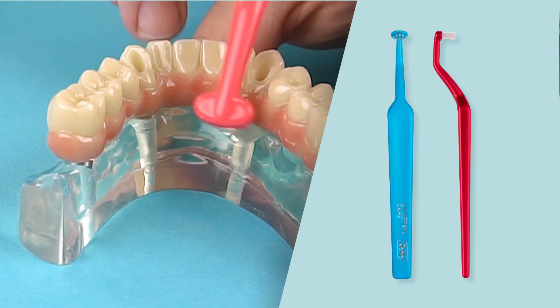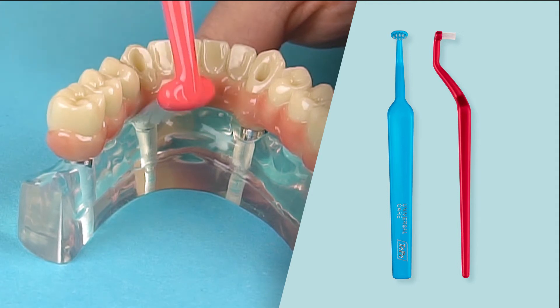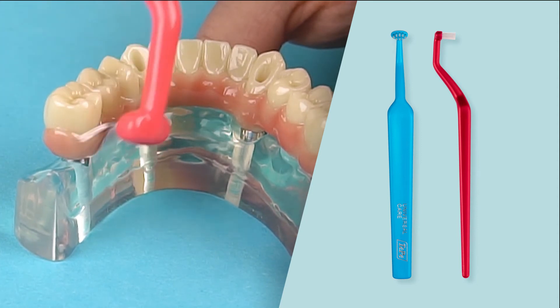The angle of the neck is perfectly suited for the inside surfaces of the teeth, while the slim head ensures you can squeeze in even the narrowest areas. The bristles are end-rounded, making it gentle on your gums.